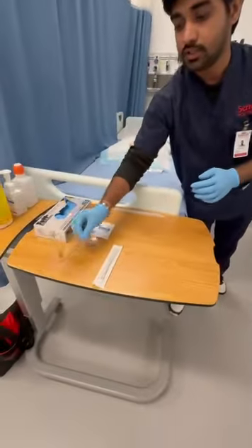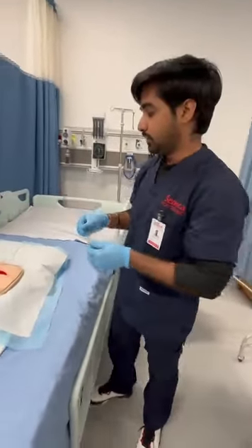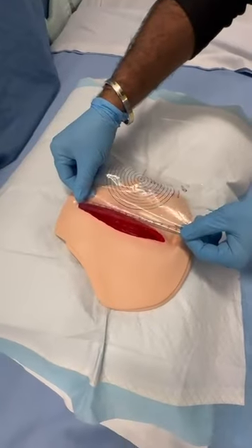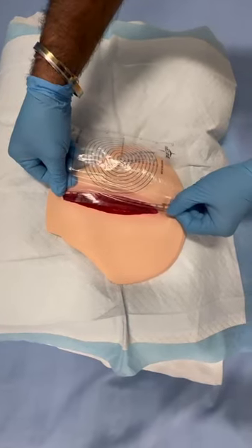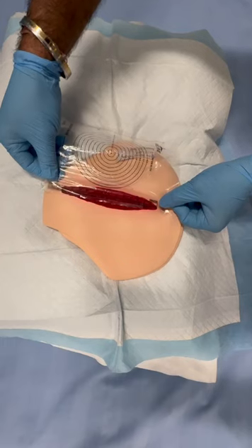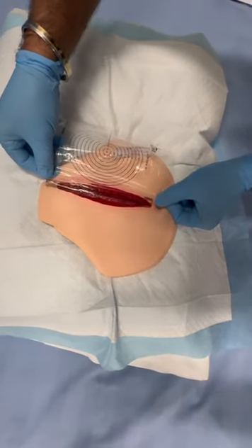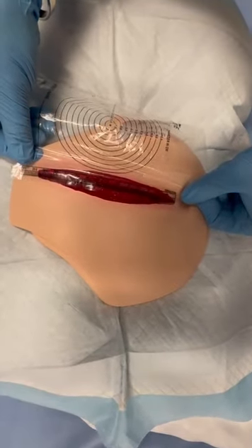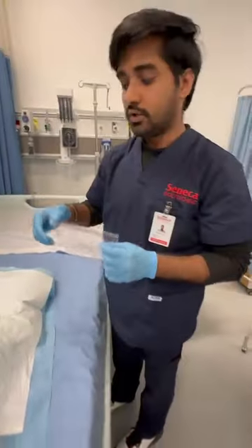Okay, that's our assessment. Now I'm going to check the wound's dimensions, like how long and how wide it is. We're going to use the scale to assess the length and width of the wound. For the length, I'm going to use the longest edge to the end of this. As you can see in the camera, it's almost 13.4 centimeters in length.